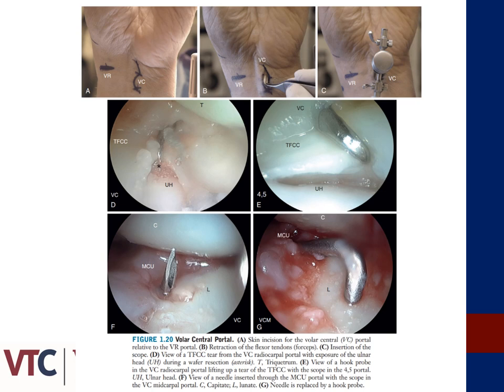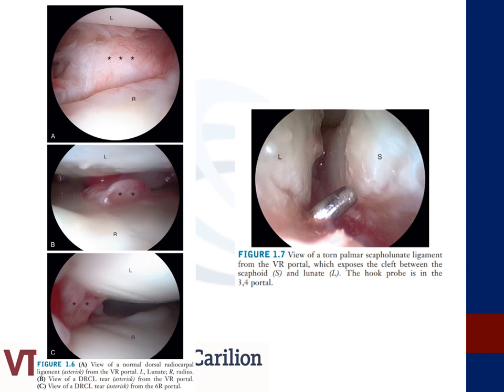The bottom images are viewed through the volar portal and represent instrumentation into the midcarpal ulnar portal. Images through the volar radial portal highlight what the VR portal is best at identifying arthroscopically. The top left image represents the normal appearance of the dorsal radiocarpal or DRC ligament, while images B and C represent tears of the dorsal radiocarpal ligament. The image on the right represents a tear of the volar aspect of the SL ligament as viewed through the VR portal.